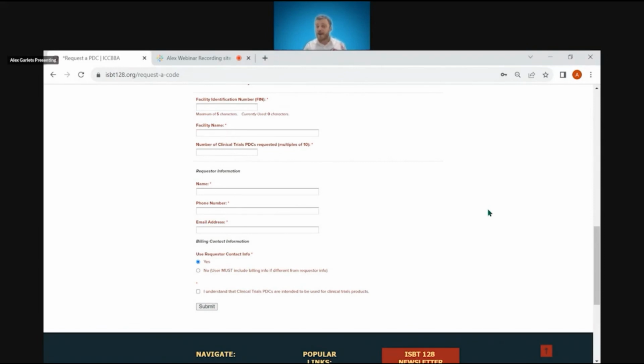Now, while we are here, I do want to mention that requested clinical trials PDCs only come in batches of 10. So when you do request these PDCs, please ensure that you request a multiple of 10. Now, if you would like more information regarding clinical trials PDCs and their use, we did just recently produce a video outlining that exact topic.